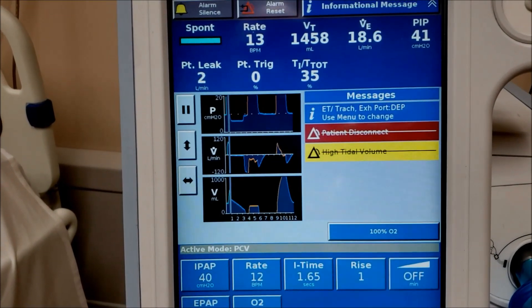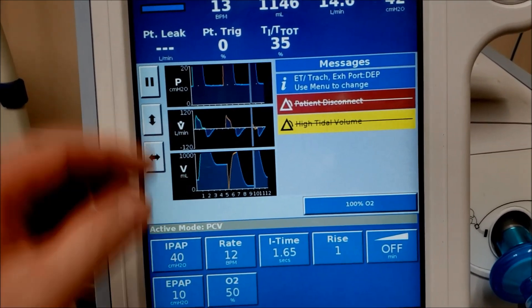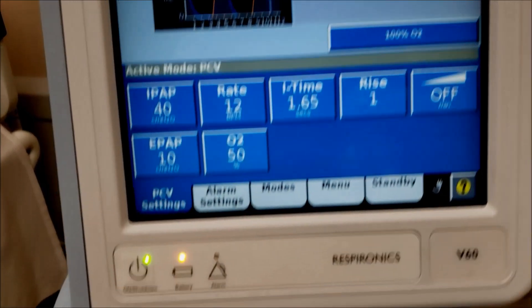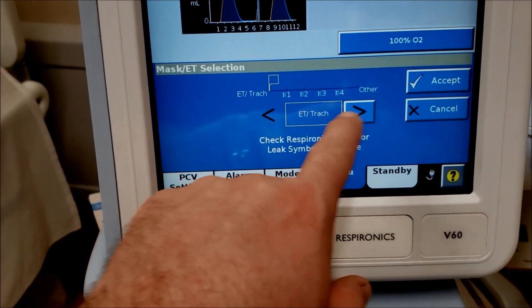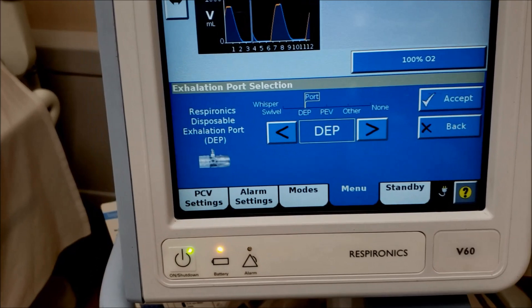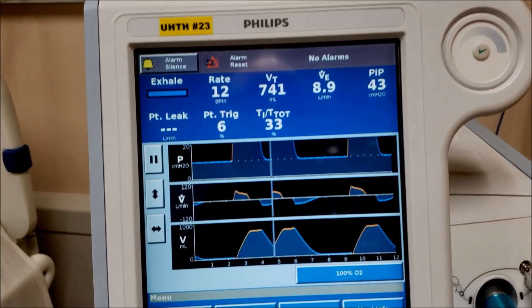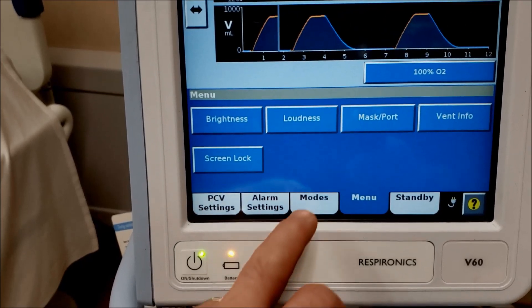Let's look at our settings. You'll see ET trach and other alarms — once they're crossed out they're no longer functional, so we reset those. It wants me to address what type of interface I have: mask or ET tube or trach. Go to menu, then mask port, and tell it whether you have ET trach, mask one, mask two, mask three, mask four, or other. Select and accept. Then it asks what type of expiratory valve — this is a Respironics valve. Accept that, which gets rid of the annoying messages.